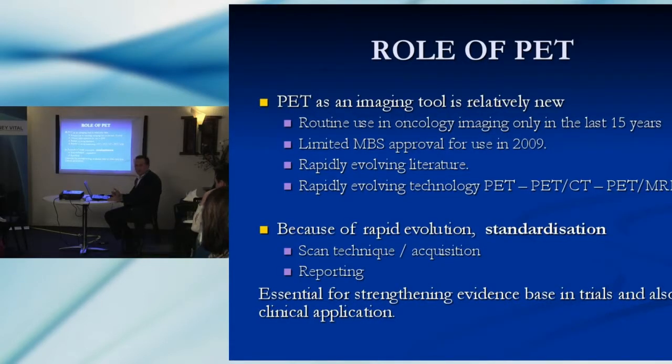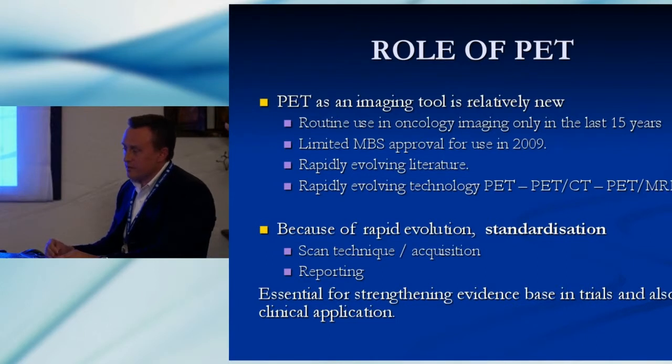As an aside, looking at the role of PET-CT or PET, PET as an imaging modality is relatively new. We've only seen it really take off in oncology imaging in the last 15 years or so. In Australia, we've seen limited MBS approval only in the last 5 years or so. Literature has been rapidly evolving, and also the technology has been rapidly evolving.